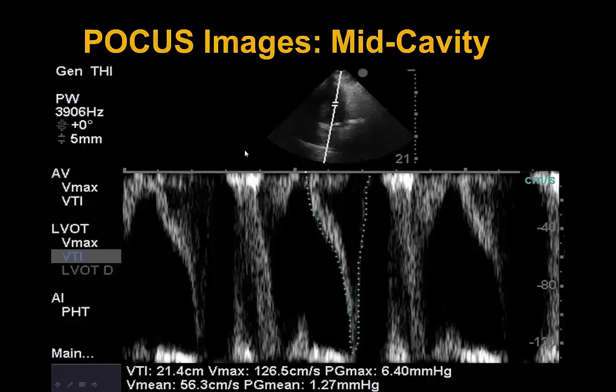Using pulse wave Doppler, we creep along the mid-cavitary segment to assess for a mid-cavitary gradient. We see a very typical dagger-shaped VTI, which is suggestive of intracavitary hypertrophic cardiomyopathy. The VTI measures 21, with a max gradient of 6.4 and a mean gradient of 1.27 mmHg. Although these gradients appear modest now, if the left ventricle were underfilled, the peak and mean gradients would be significantly more pronounced. The dagger-shaped envelope is the key finding consistent with HOCM.